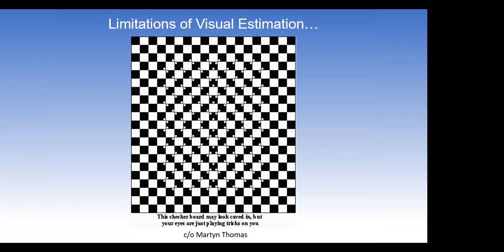That said, our eyes are lying to us all the time. If you look at this picture, the question is which line is straight? And your eyes would tell you that it's essentially the lines just on the outside. But when you make a straight line, all those lines are straight, just those little small squares make it look like it's not straight. So this is in a cath lab on angiogram for shortening of the vessel. So the vessel not only has to be positioned the proper way with the long axis of the lesion towards the X-ray, it has to be quote unquote open, i.e. not foreshortened and demonstrating all alike.